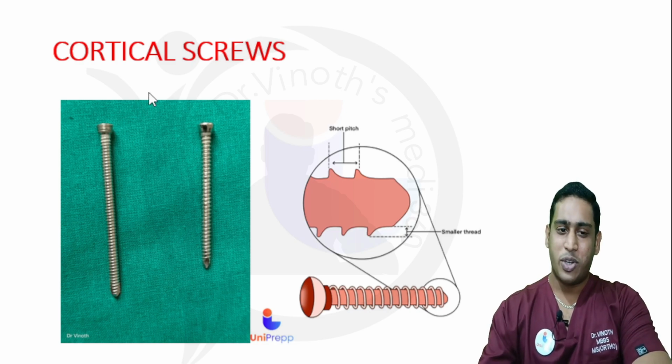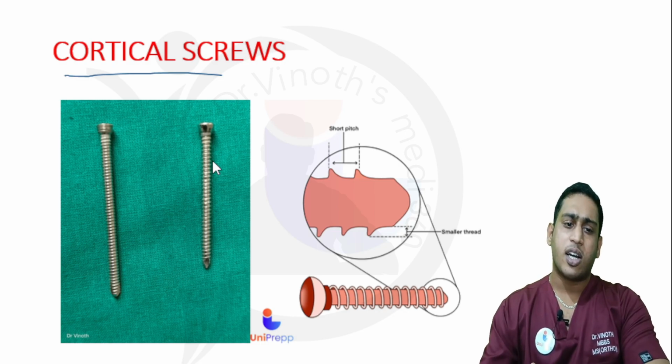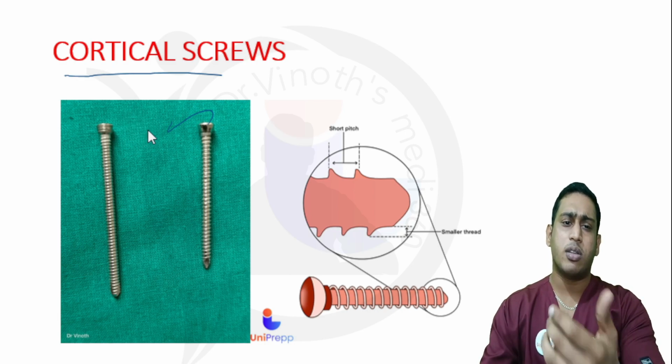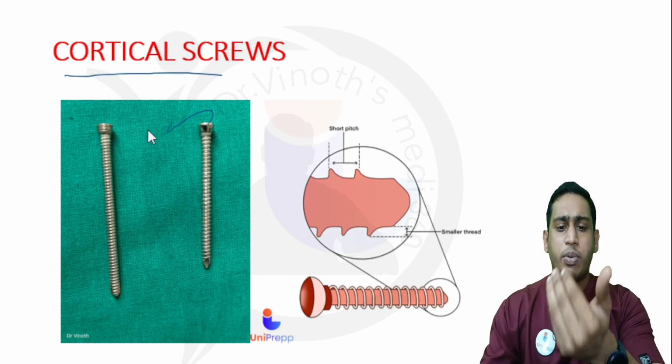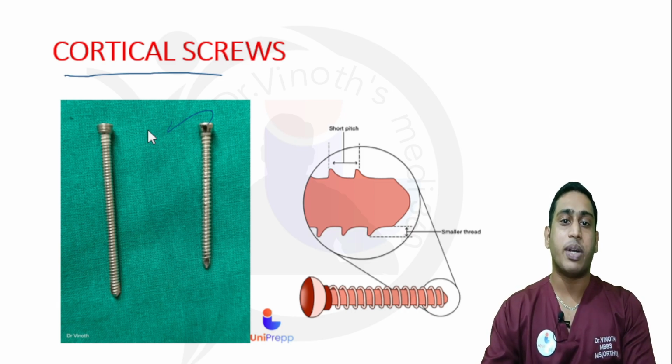Now coming to the screws. This one is called a cortical screw. Why is it called a cortical screw? Because it is applied to the bone cortex or the diaphyseal cortex. The cortical screw can be applied through the plate, or it can be applied directly to the bone without going through the plate. There is a different name for that principle: it is called a lag screw or interfragmentary screw.